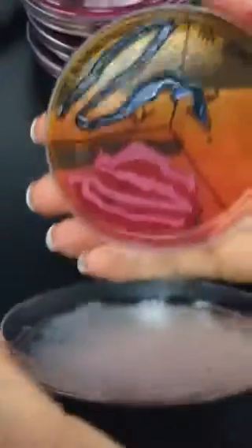Now, some of the tests we do in the API strip are going to be the same test that you did on your plate, and it will turn black. Another test will be for lactose or whatever, so we do some of the same tests on the API strip. But I just like it on the agar because you can see it.